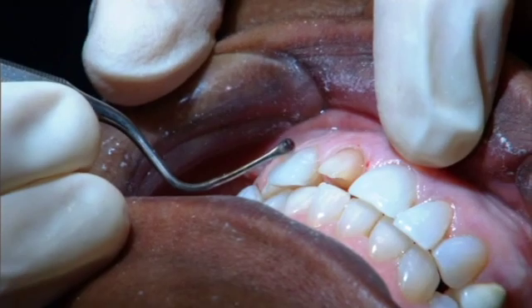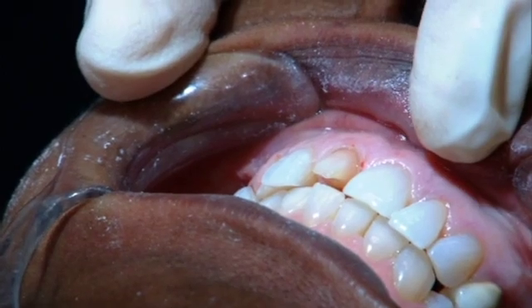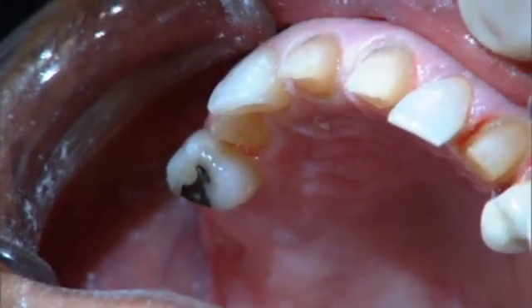Okay? What I'm going to do now is jump to the other side, do exactly the same thing we just did, and then we'll bring the tape back up then. Okay. Now that we have the abutment teeth prepared, this is just a roughed out preparation.